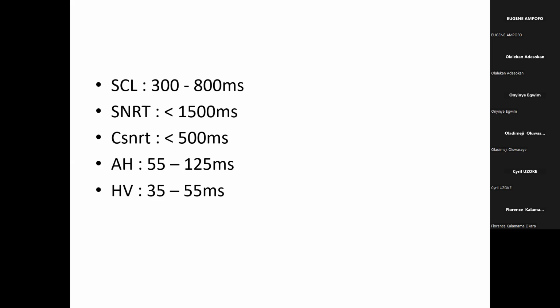Remember, I showed you all those catheters in different segments of the heart. That catheter, you can use it to stimulate any segment of the heart that it is touching, and you stimulate it to run faster. So you pace the heart faster than the pacemaker of the heart. So the question now is, when there's an area running faster than the pacemaker, and you abort that area, what is the time interval it takes for the SA node to recover its activity? That will also tell us how functional the SA node is.